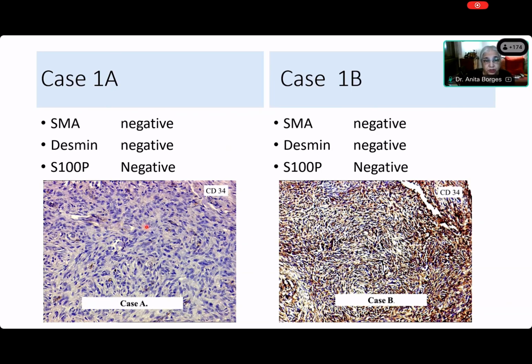Now you see the difference between the CD34 expression in a dermatofibroma versus a dermatofibrosarcoma. This on the left-hand side is a dermatofibroma. It is always CD34 negative. If you get a storiform lesion in the skin and it is CD34 positive, there is no other diagnosis. It is a dermatofibrosarcoma, right? However bland it might look, however less cellular it is, if it is CD34 positive, it is a dermatofibrosarcoma.